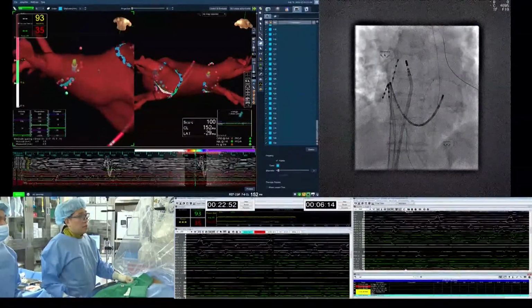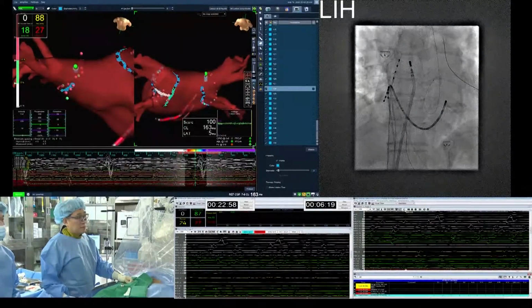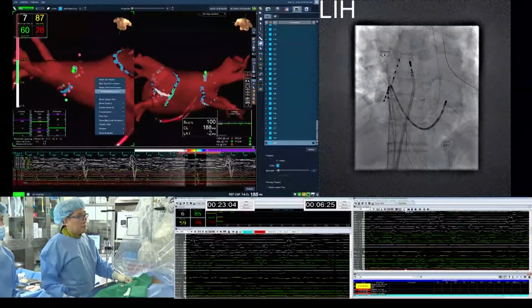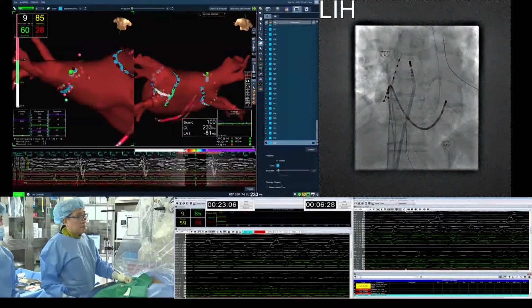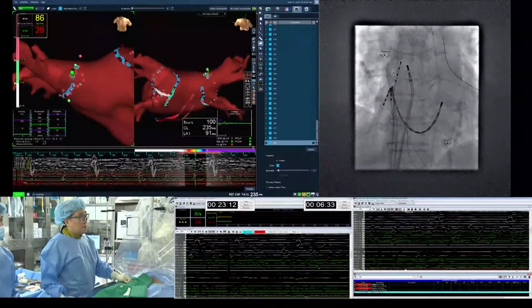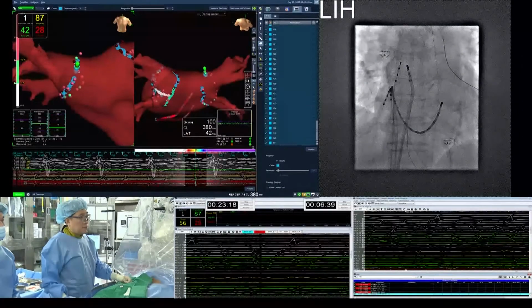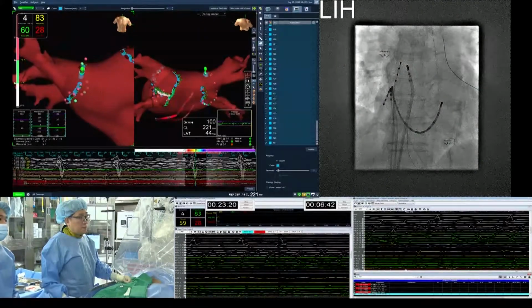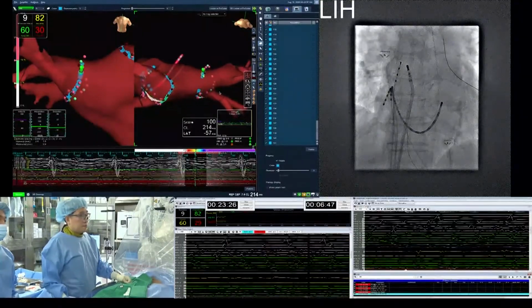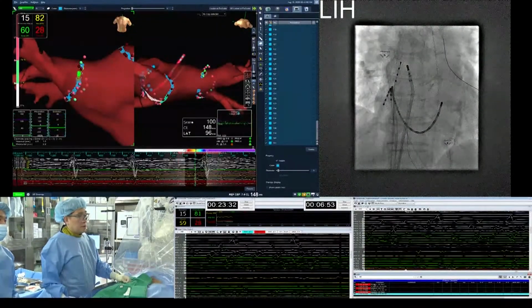The roof part of the right side pulmonary vein is also one of the difficult parts during PVI isolation. I usually try to push the catheter to the highest point and ablate more, but make sure your catheter tip location is proper. Because the catheter points straight toward the roof of the endocardial surface, and the temperature sensor is a little away from the catheter tip, there is sometimes a high risk of tamponade in this area. So don't push too much in this position.